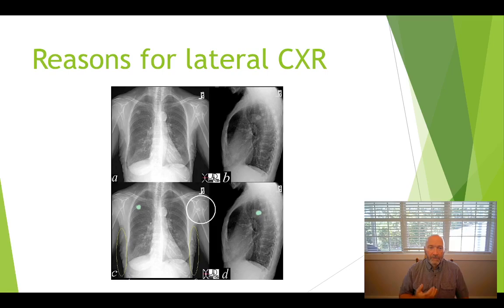So again, we do x-rays in different dimensions so that we can get a better three-dimensional perspective of what it is that we're looking for. A chest x-ray is no different from that.